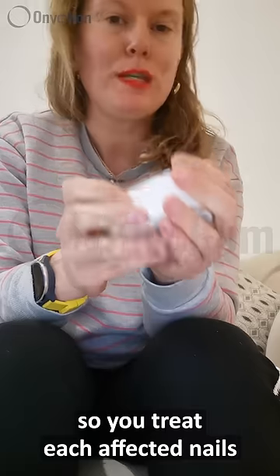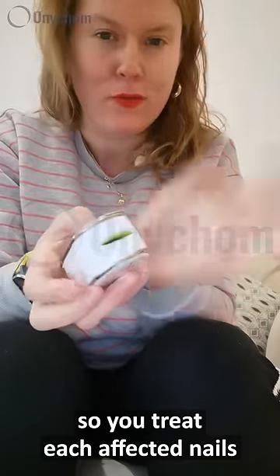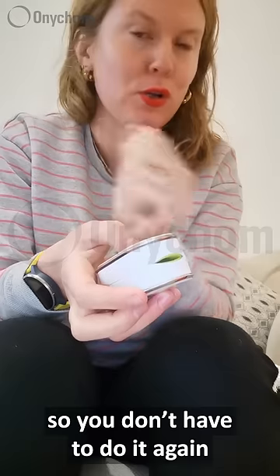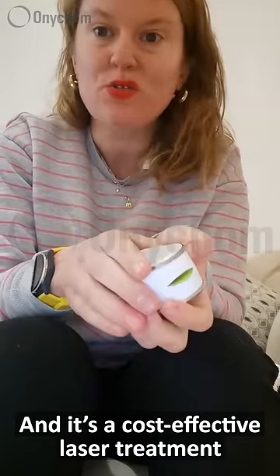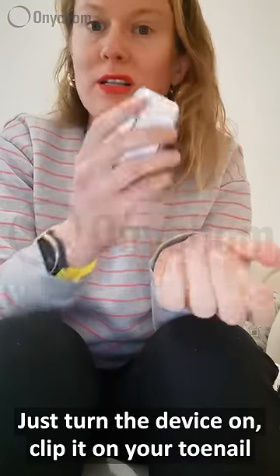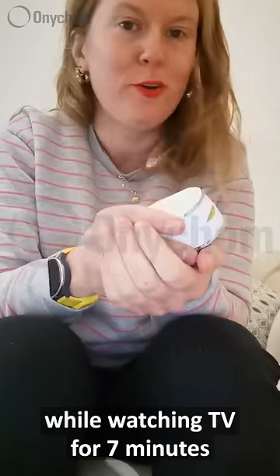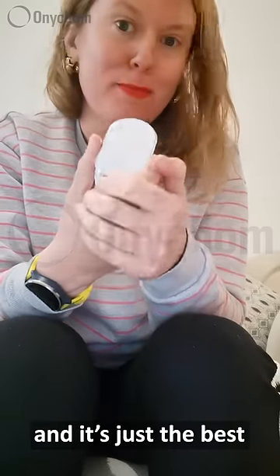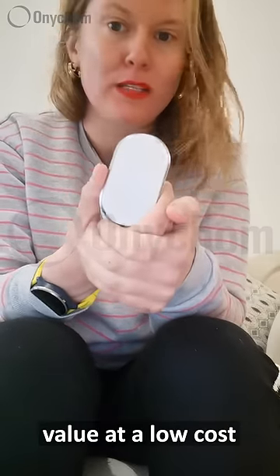You treat each affected nail for seven minutes — that's it. It's a permanent solution so you don't have to do it again. And it's a cost-effective laser treatment without a prescription. Just turn the device on, clip it on your toenail while watching TV for seven minutes, and you have a 180-day money-back guarantee. It's just the best value at a low cost.